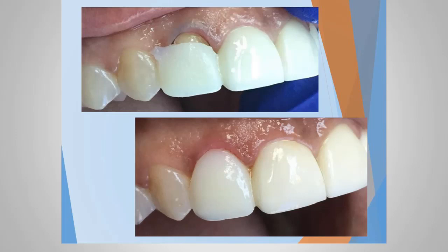The other option was to just go ahead and make a whole new temporary, keeping in mind that when I fill up this matrix with the temporary material, I have to do that in a way that it's fully filled, so that all aspects of the prep are going to be covered.